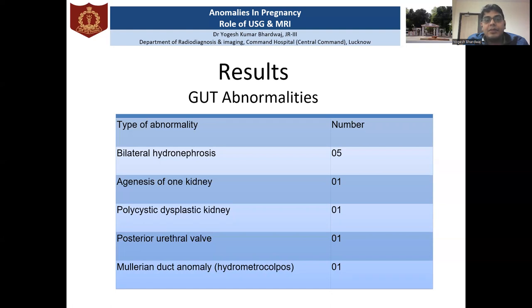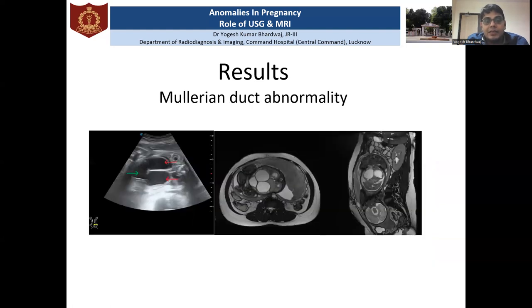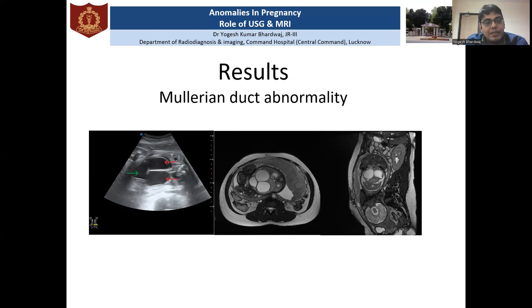The second most common abnormalities were genitourinary tract related, and the most common was bilateral hydronephrosis. One rare case of Müllerian duct abnormality was also seen. In the ultrasound image, the red arrows show the dilated uterus and the green arrow shows the dilated vagina. The uterus was separated by an echogenic septum dividing it into two parts, and because of the dilated uterus and vagina, there was compression of both ureters causing bilateral gross hydroureteronephrosis.